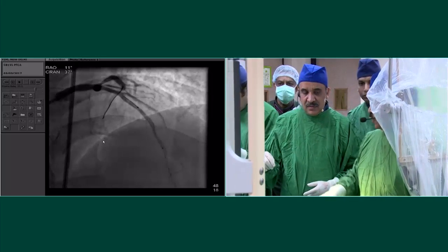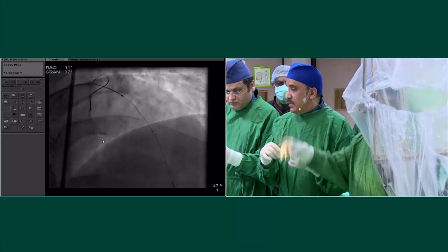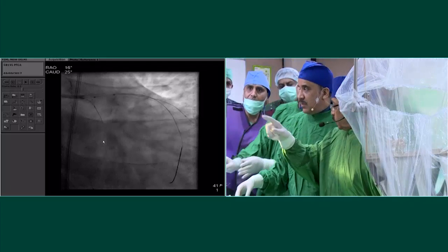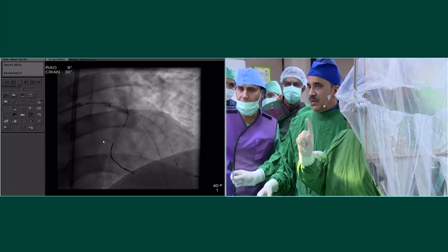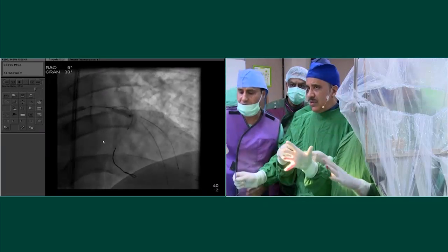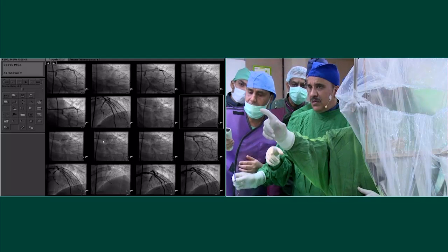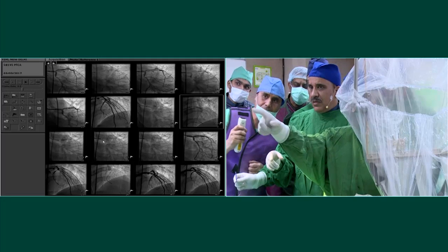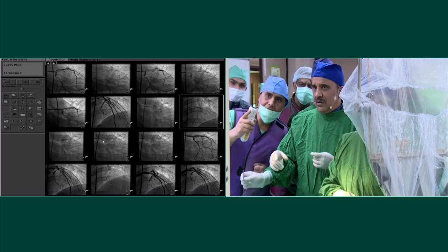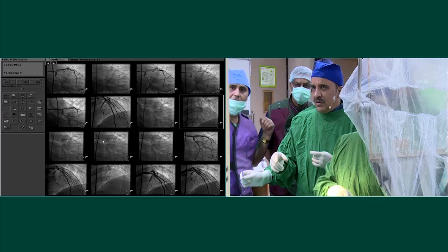Just take me back to where they left off, when I was in the diagonal, when I was trying to salvage the diagonal. Go to the grid, so that I can actually show them where they left off. You are at the point where you have dilated the diagonal now, and you are supposed to stent the diagonal. Yes, I was at the point of stenting the diagonal. So go to that one, first one. No, before that. I think go backwards. Go back.